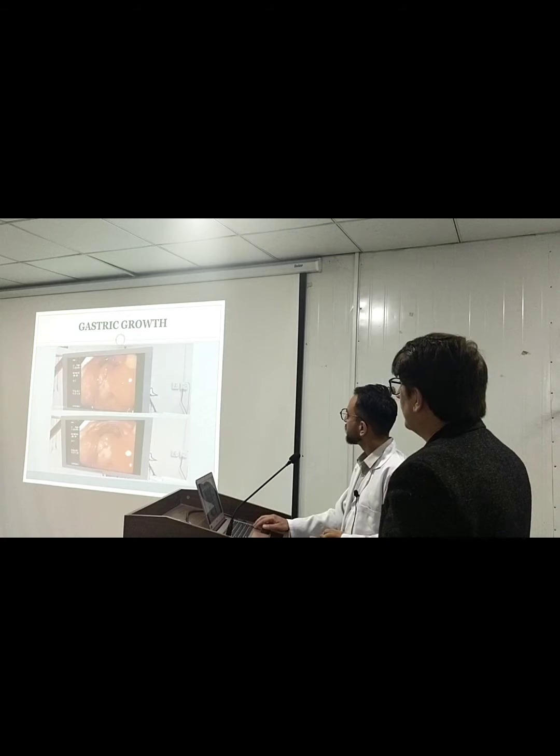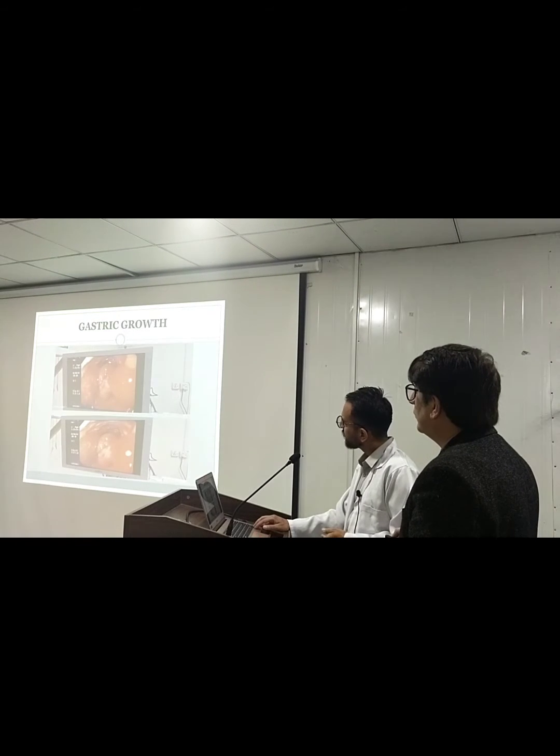Gastric growth. So this was also a gastric growth. It was also a gastric CA actually. You can see it's a large tumor partially obliterating the pylorus. So biopsies later confirmed it was also an adeno-CA.